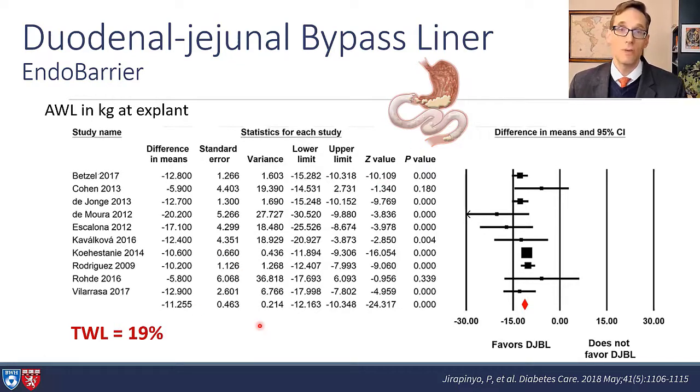It was associated with hepatic abscess formation in earlier U.S. clinical trials, and now it's back under study in the U.S., and so far we have not had any return of these liver abscesses in the new protocol.